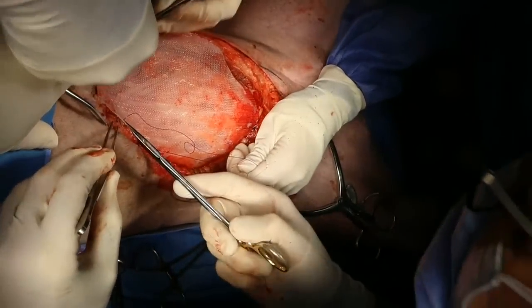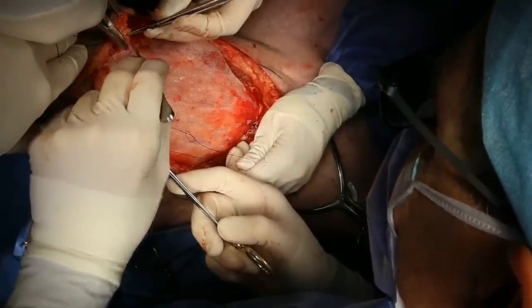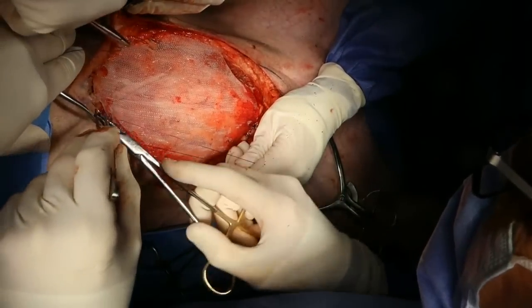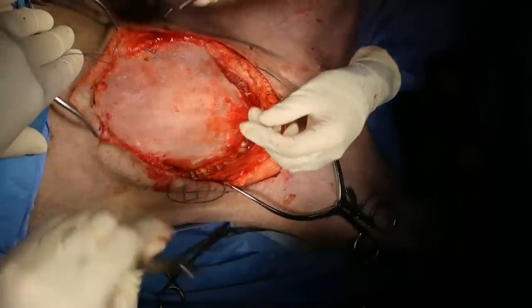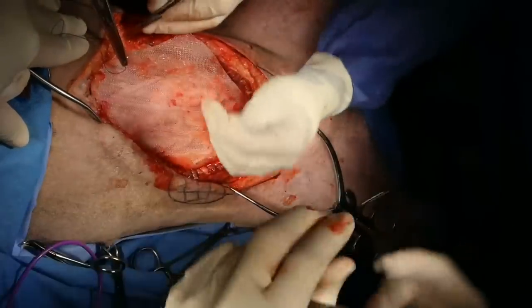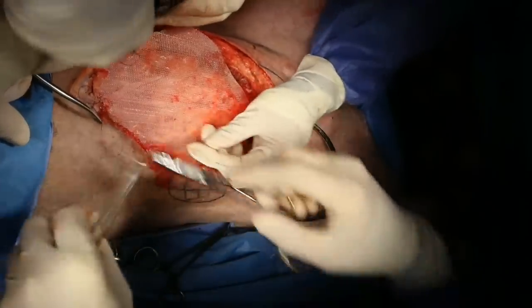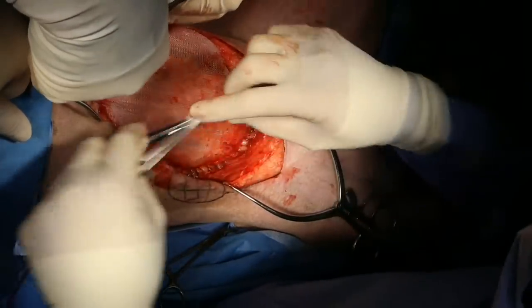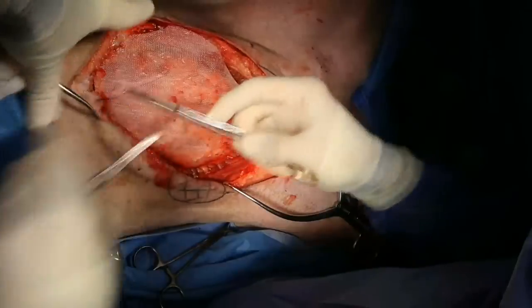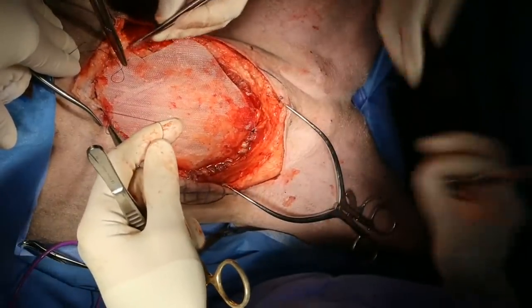With this, Charles? So you're getting the outside of that layer? Yeah, that's good. Just want to make sure we're not leaving any pocket that the intestines could sneak out and herniate. And I have prepared both flank fold flaps in case we need them to close, but I really don't think we will. As soon as I'm finished with this suture line, I'm going to just have a play with the skin and see how that's going to come together.